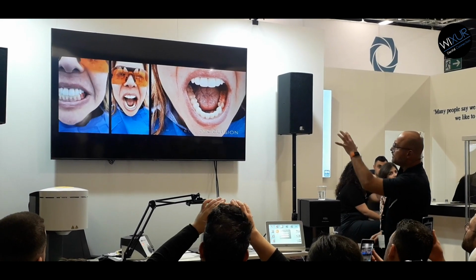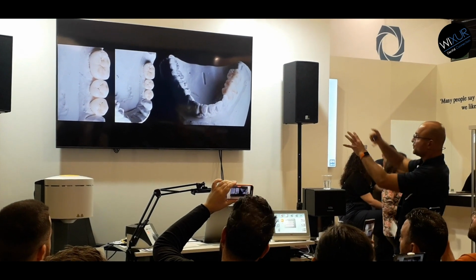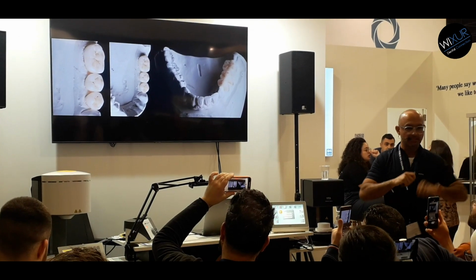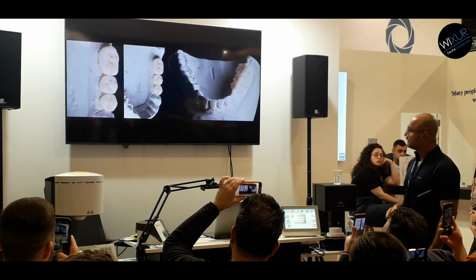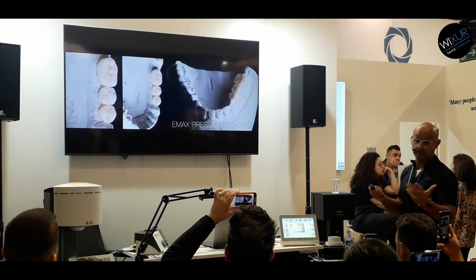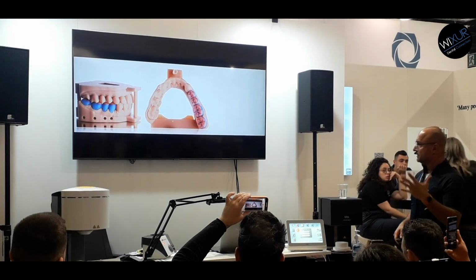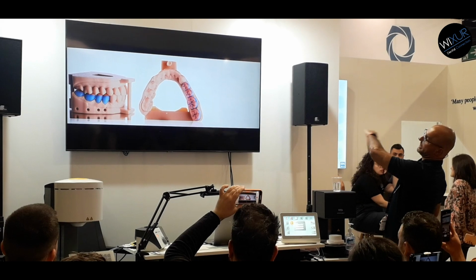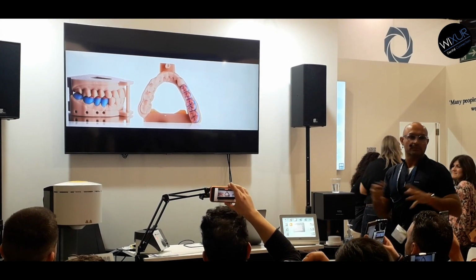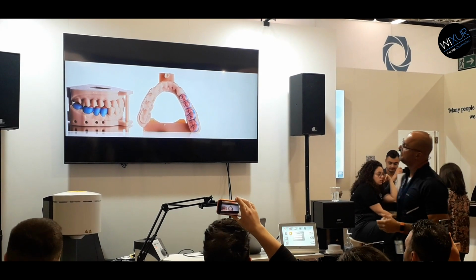So, now, she created the best occlusion that she has. Now, the surface of the wax is holy. I don't change it. I just clean it, I make it nice. I press it by lithium disilicate, LT bleach 2, because she wanted, of course, to have bleach. Everybody wants bleach. I just make it a little bit nice and then bond it. So I use the digital technology. I create the crowns because this wax is expensive and I don't have much. So I just wanted to use it efficiently.